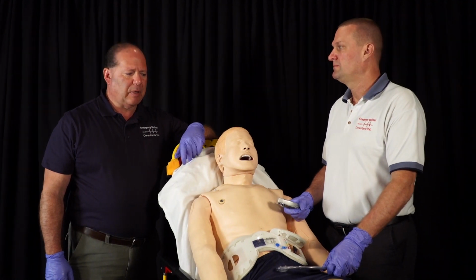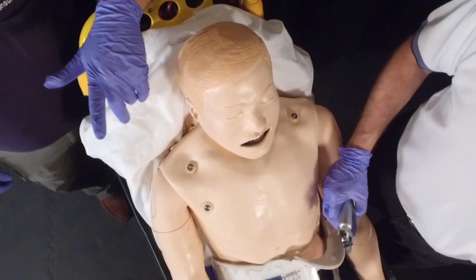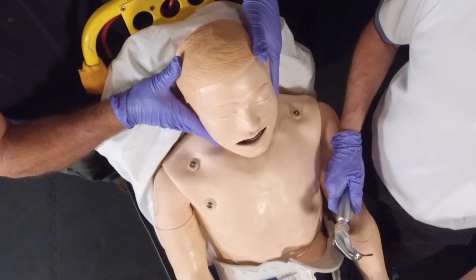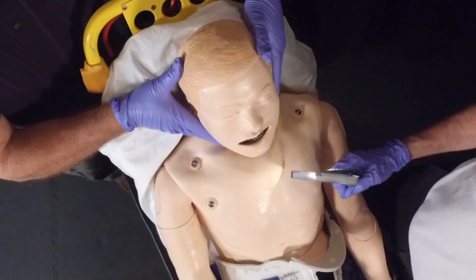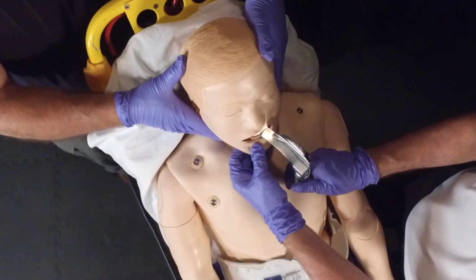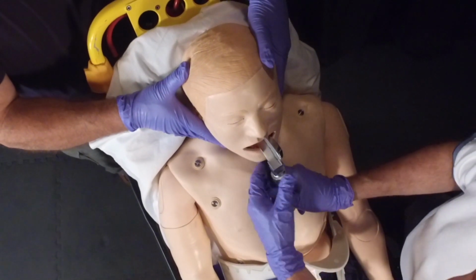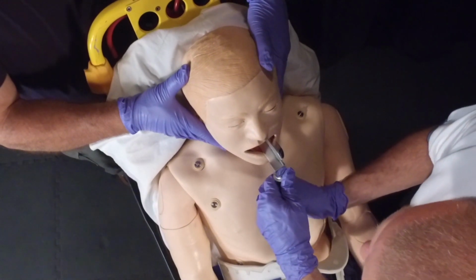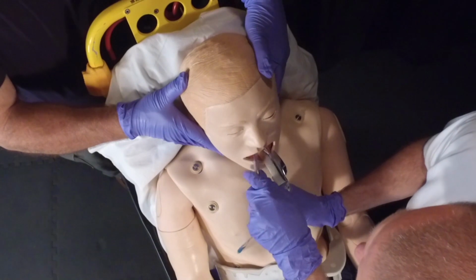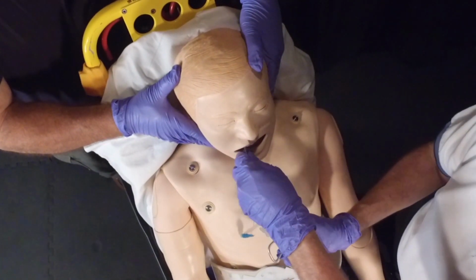It frequently takes two people. If we were considering this patient to have a spinal injury, we would put a collar on his neck. But one person would hold the patient's head in a neutral or airway open position based on what we were trying to do. The intubator has to put the blade in his right hand, finds the vallecula, and then pulls forward to see the glottic opening. The left hand then places the tube. So this is the opposite hands of what you would normally intubate with.